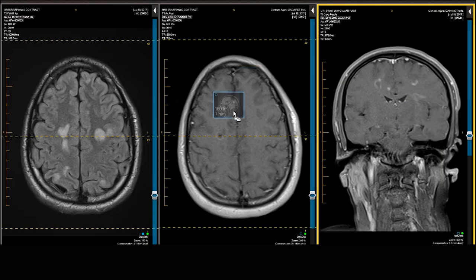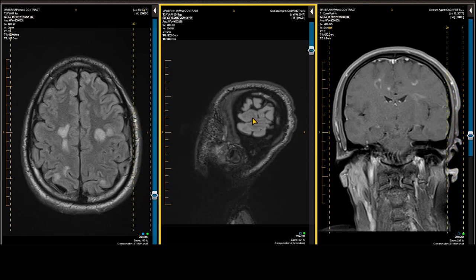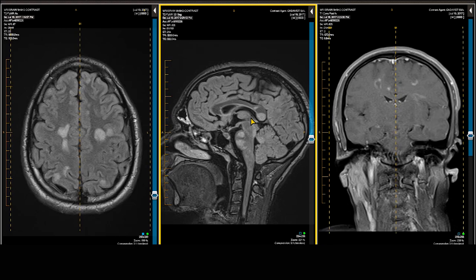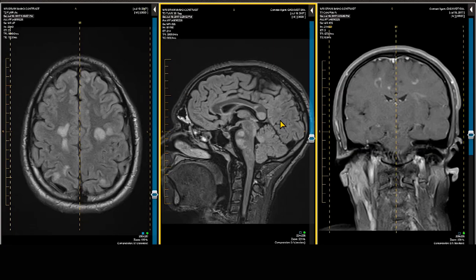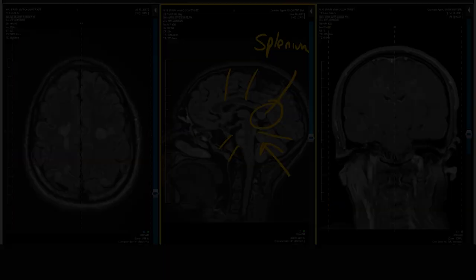I want to show the sagittal FLAIR scan. After looking in the axial plane, I also look at the sagittal FLAIR scan, which shows the midline structures optimally. Here we have the corpus callosum, and we see the large area of demyelination in the splenium of the corpus callosum. You also note brainstem involvement as well as some cerebellar involvement on the sagittal FLAIR image.